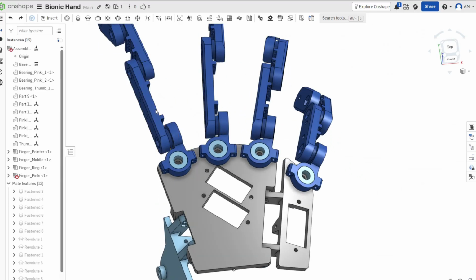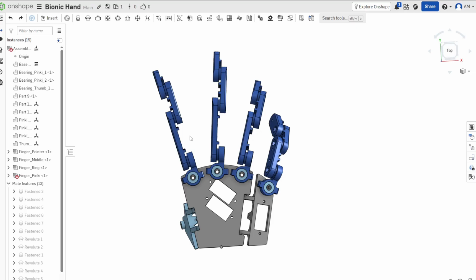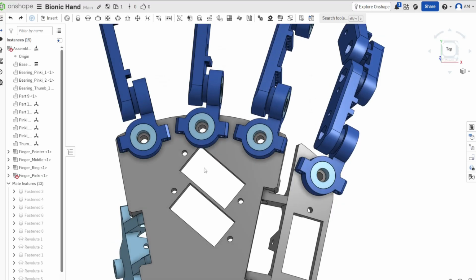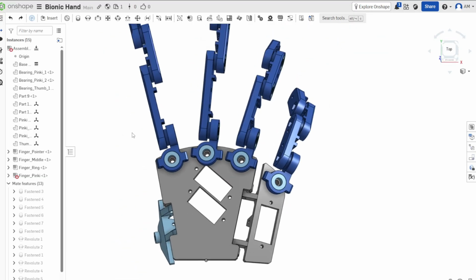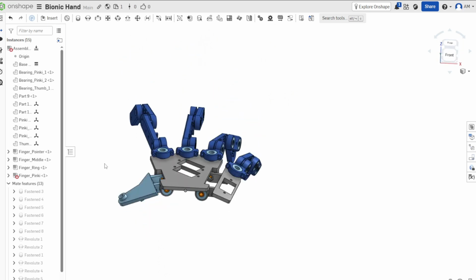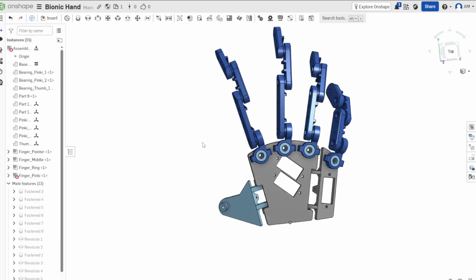Assembly is pretty easy. You just screw this stuff together. All the finger lengths are modular, as well as all the stuff in here, so you can really customize it. The idea being that you would measure the good hand you have, get the proportions correct, and then set up another hand. So right now it's all right hand based, and if it goes the way I want it, I should be able to just mirror it and have a second.